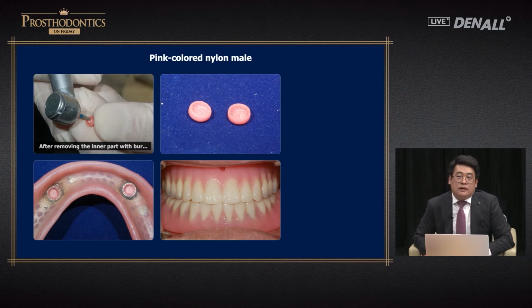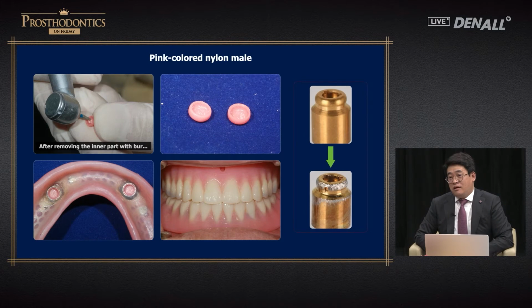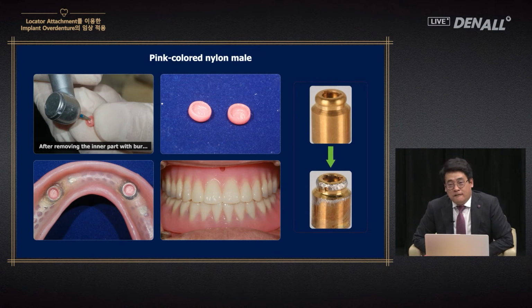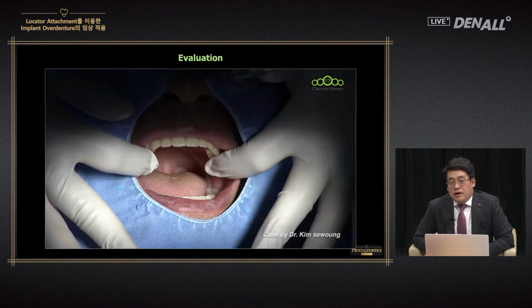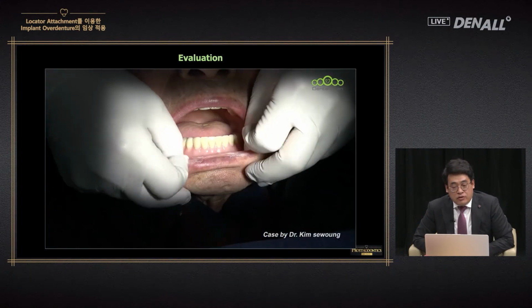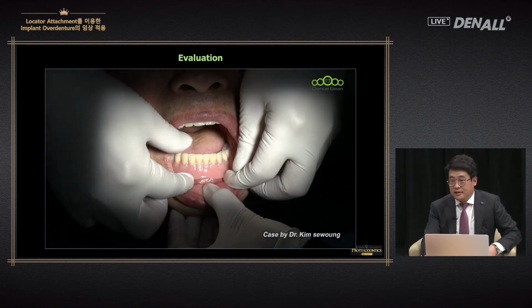And I started to ponder why the design came to be. And I realized the reason as I did long-term follow-up with a patient where wear occurs like this. So in this case, even if you change the blue to a new one, it's insufficient. Therefore, in this case, you can use pink or white. Don't throw them all away and save a few. You check whether it is attached properly and do occlusal adjustment.